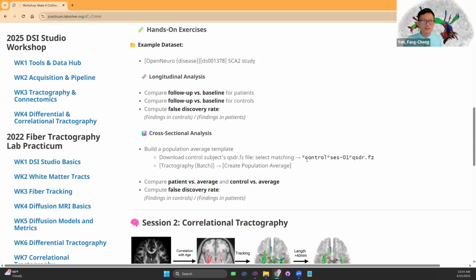An easier way would be just getting an average of them, and then compare and see the results. If there are additional factors like age, sex or other demographics, we handle that at the end of the statistics. For example, if we get some results using differential tractography, we get some findings from patients 1, 2, 3, 4, 5, and we can collect all the data.